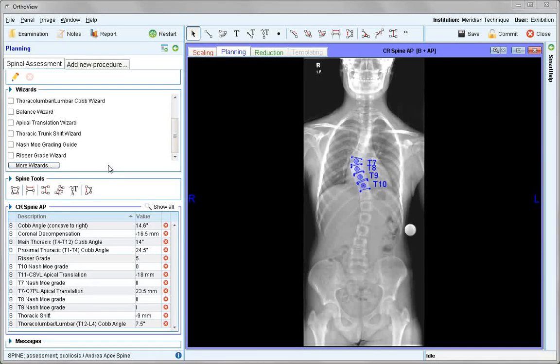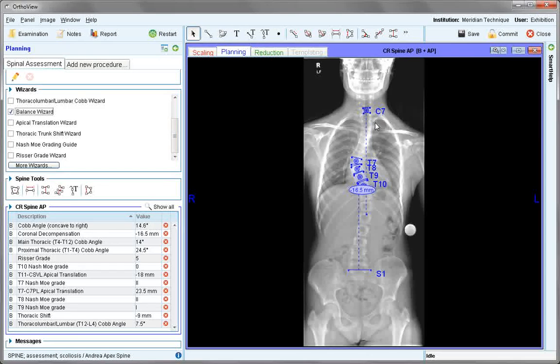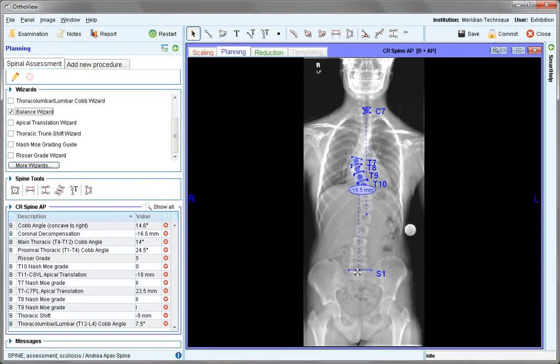Now looking at the full spine view again, we look at the second half of the wizard set, beginning with the balance wizard. This sits across S1 and C7 and gives you a value for compensation or decompensation depending on whether C7 is to the left or to the right of S1. If the reference vertebral bodies have been previously identified and named, the balance wizard will automatically identify these points.